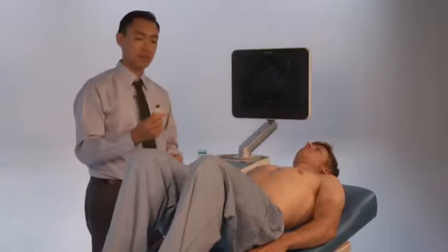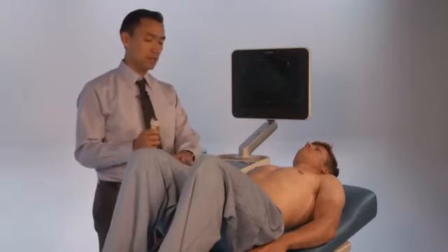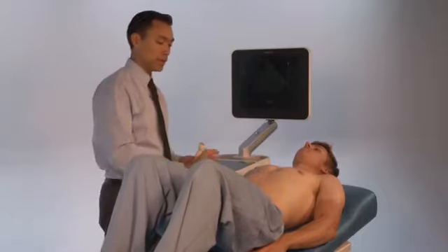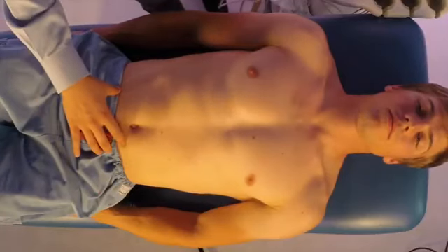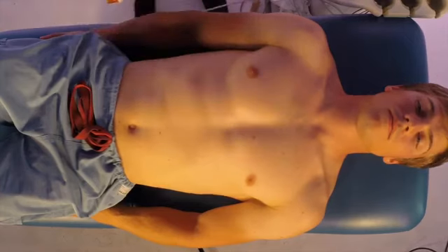So here we're going to use the phased array probe. The patient is going to be in a supine position because it's in a trauma setting, so they're usually lying flat. You're going to assess the right upper quadrant, the left upper quadrant, the pelvis, and then you're going to assess the heart and then the lungs. And we'll go through it in that order.